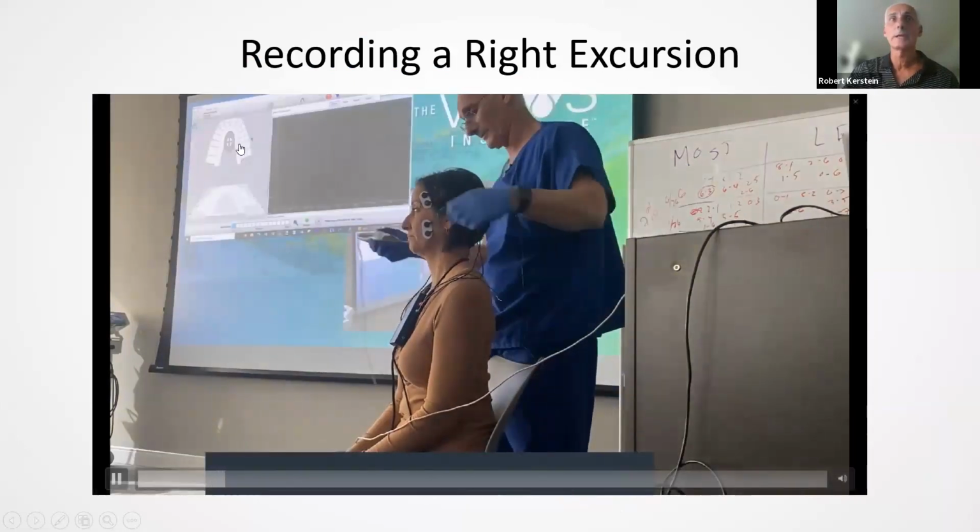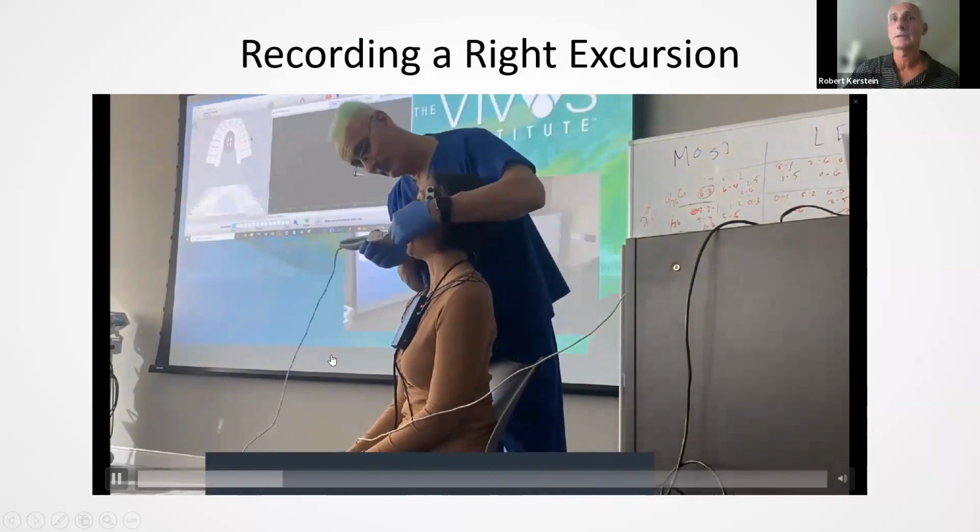I have a blank screen up. Someone's talking in the background.